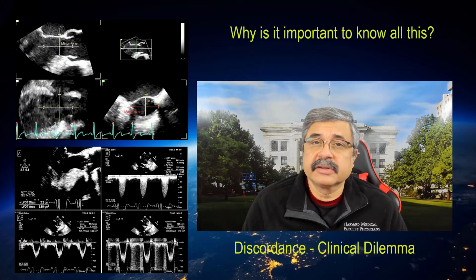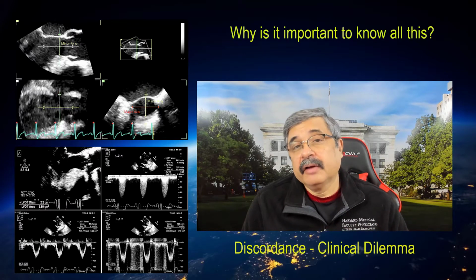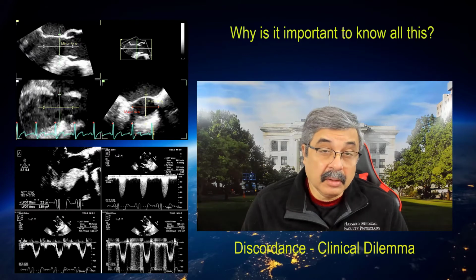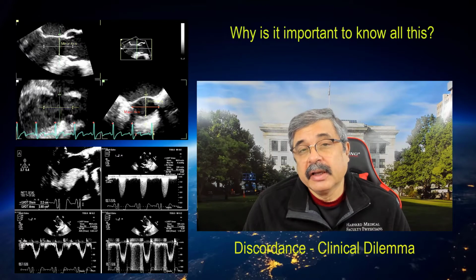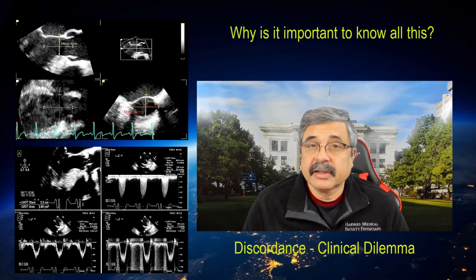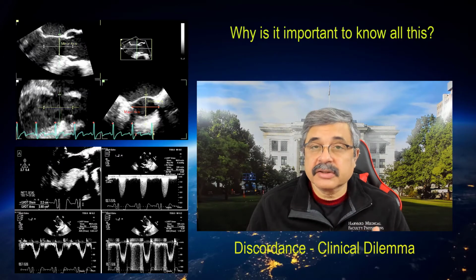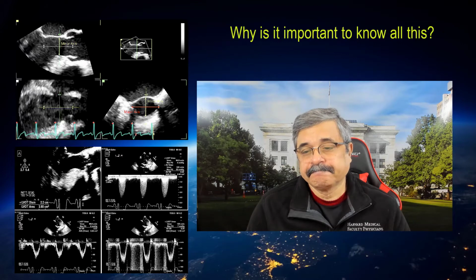So there's a lot of differences between the way the areas are calculated, but are they big enough to impact the discordance to the point that the clinical decision may change? That remains to be determined. Therefore, we've reviewed the hemodynamic principles of the continuity equation as well as the Gorlin equation and seen whether these areas and the discordances in the calculation of these areas are due to these methodological differences in the assumption of constants and flows in the LVOT and across the aortic valve.